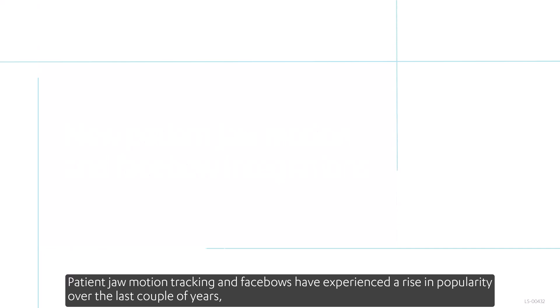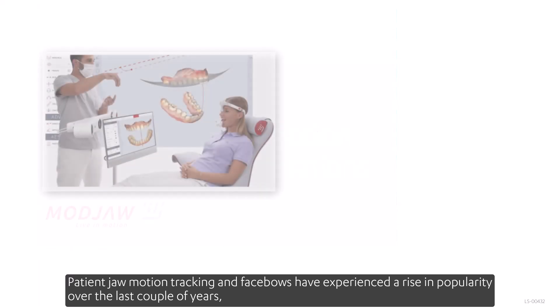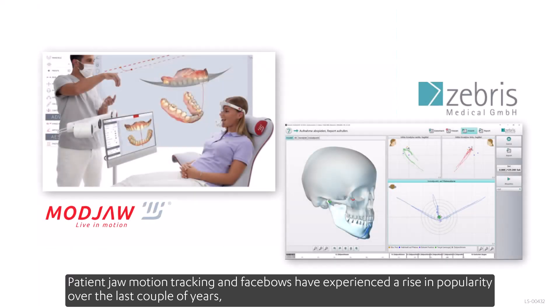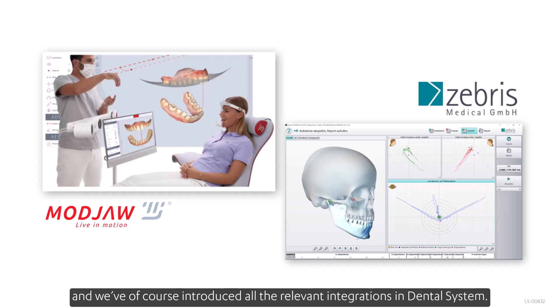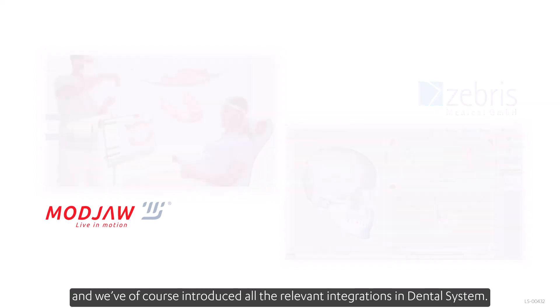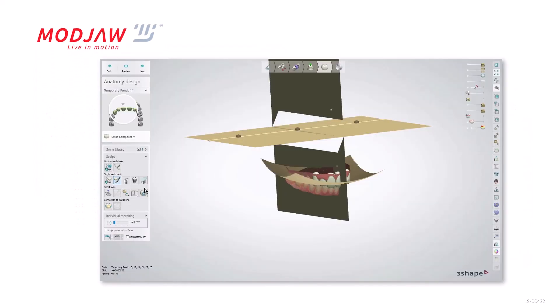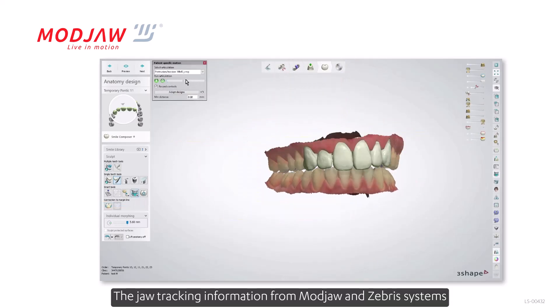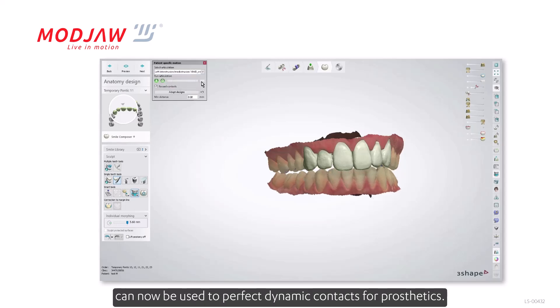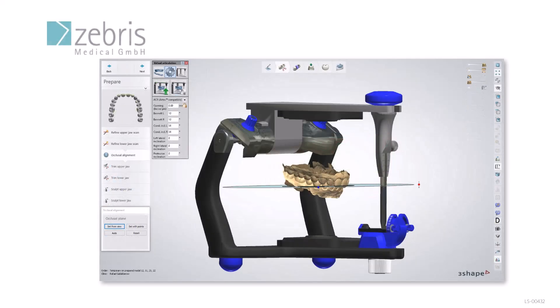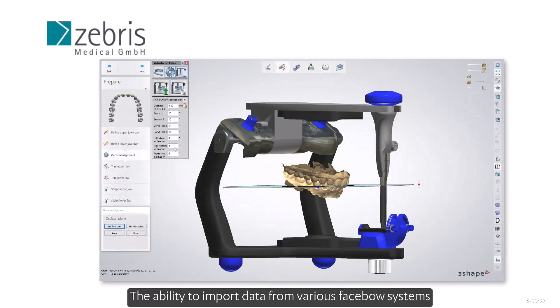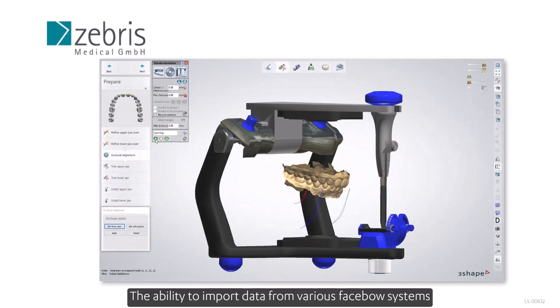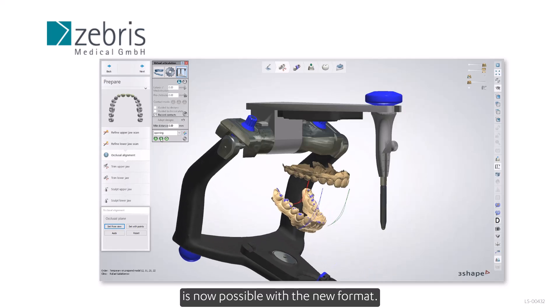Patient jaw motion tracking and face bows have risen in popularity, and we've introduced all the relevant integrations in Dental System. Jaw tracking information from MODJAW and Zebris systems can now be used to perfect dynamic contacts for prosthetics, and the ability to import data from various face bow systems is now possible with the new format.